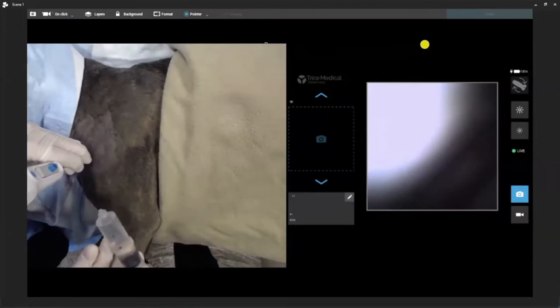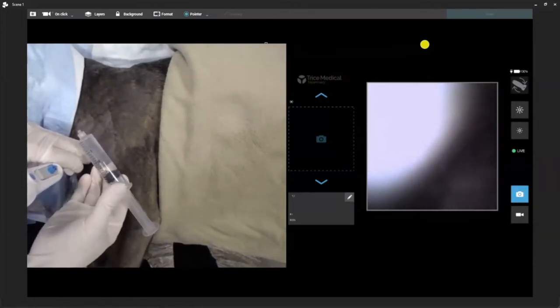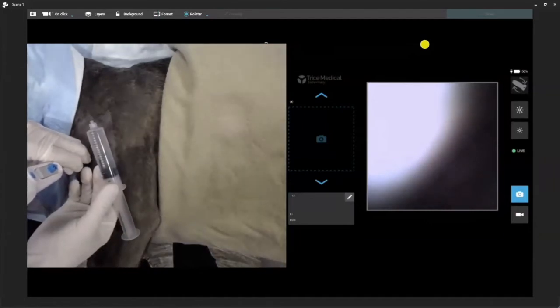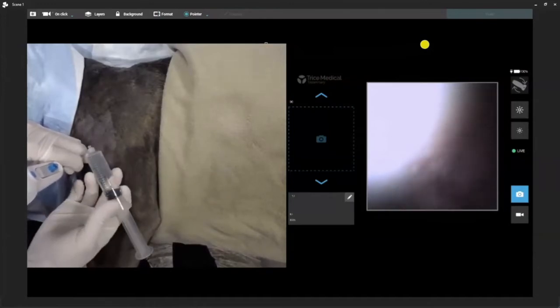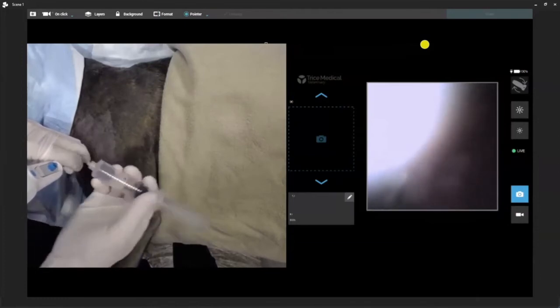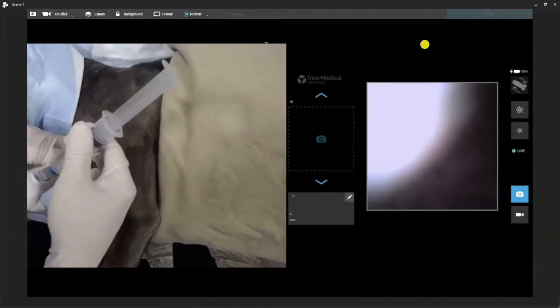Now, there are a couple of things you can do. We can go ahead and use a 20cc syringe with some saline — that will be our fluid for ingress and egress — or we can connect it to a fluid pump. Either is fine. If you're going to do a treatment, usually I do it with a fluid pump. If I'm just doing it for diagnostics, it's easy to just manually apply fluid with a syringe. So let's go ahead and apply this. Our optics are there.